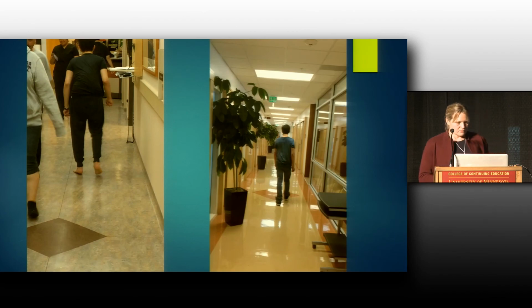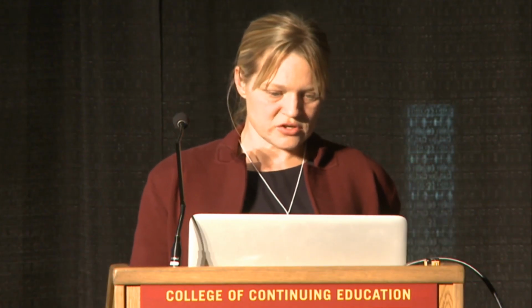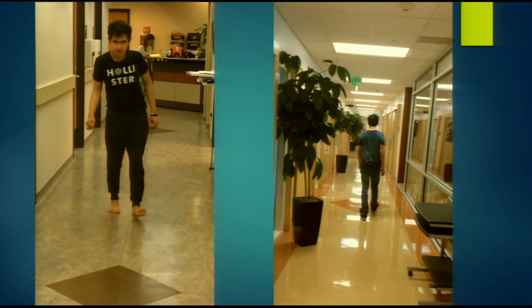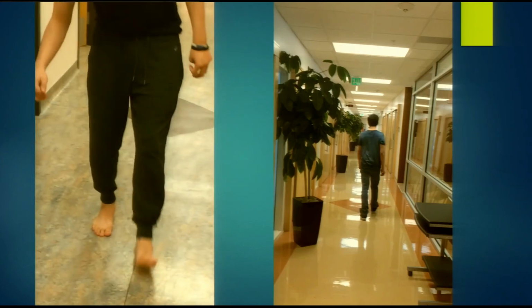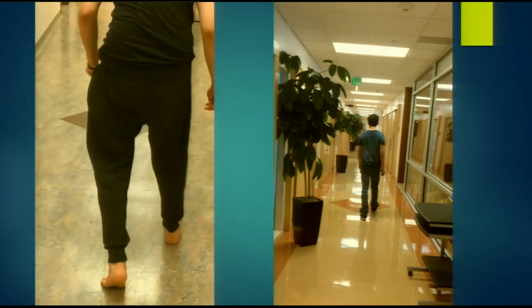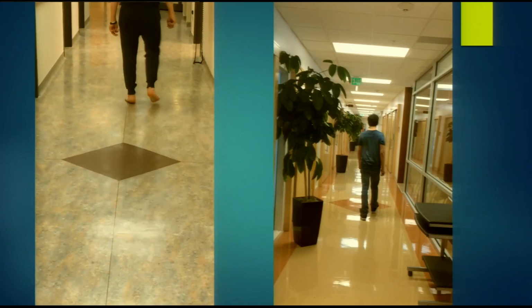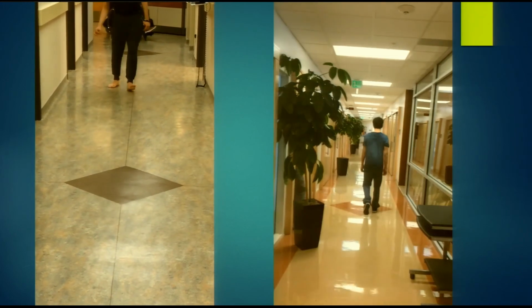So the most well-known DBS treatment for dystonia, here's a patient with what they call DYT1 dystonia. He's 14 or 15 here, and you see he has spasms involving his trunk into the leg. The shoulder goes as well. You can see his hands will posture. We have a little bit as well, inversion on the left. And then I'll show you an example of, and this is why we're thinking about it for other types of dystonia.